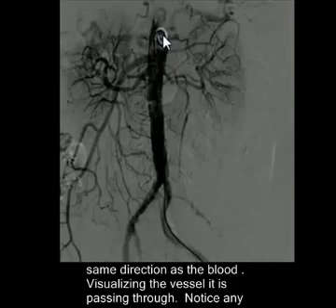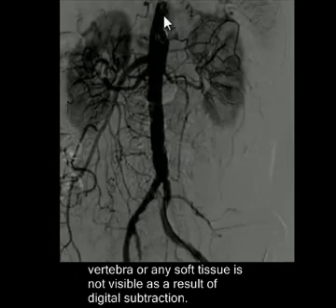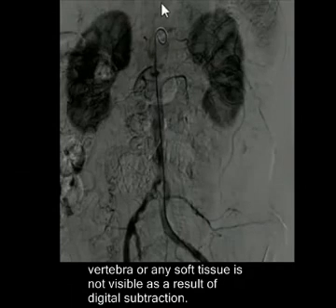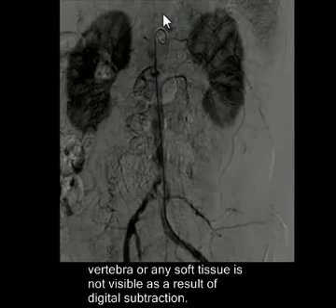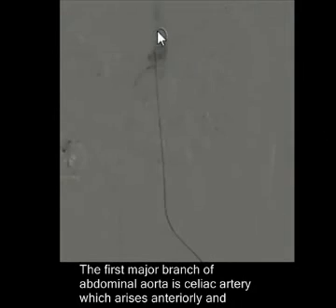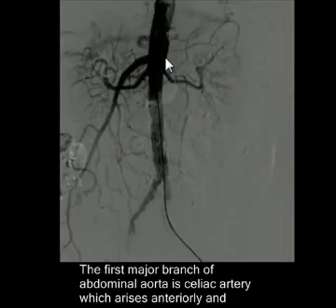Now ideally the tip should be above or at the level of the 12th thoracic vertebra, so we can see the whole of the abdominal aorta. In this case it is probably just below the ideal position. So the first major branch, which is known as the celiac artery or celiac trunk, is just visible. If the catheter was just above this point, you would be able to clearly see the three branches of the celiac artery.